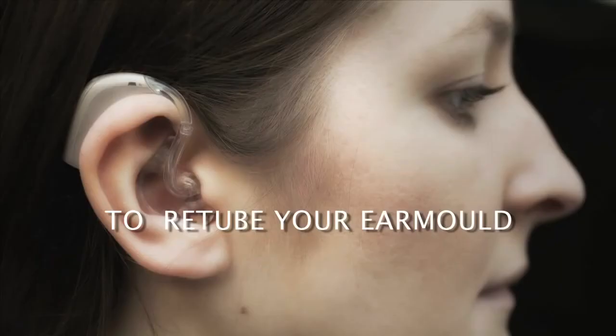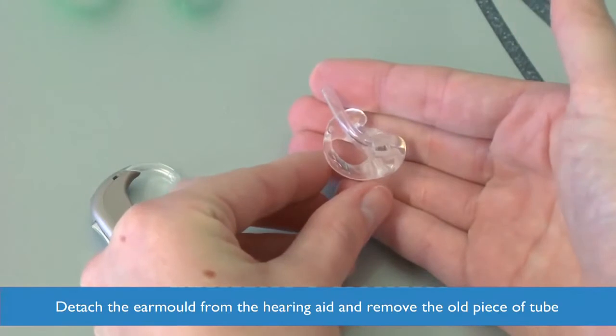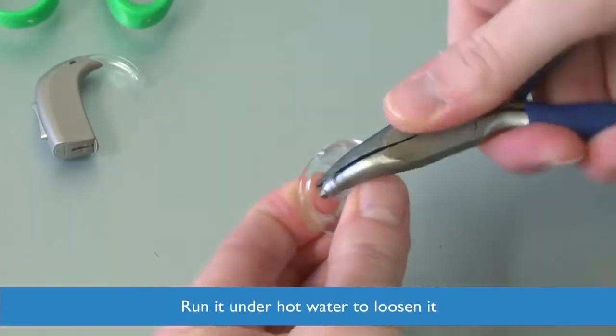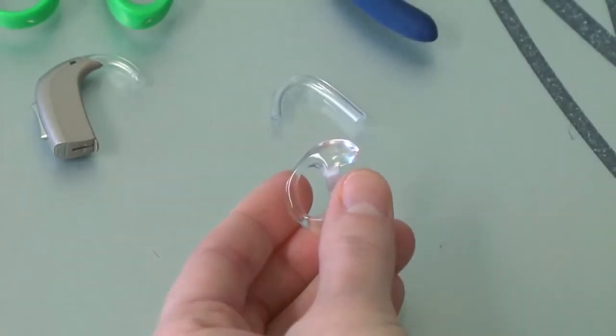I have a problem with my hearing aid. To retube your ear mold, detach the ear mold from the hearing aid and remove the old piece of tube. You may wish to run it under hot water to loosen it. Don't throw it away as you will need it in a moment.